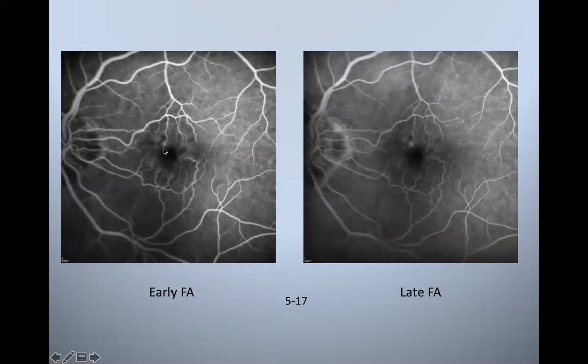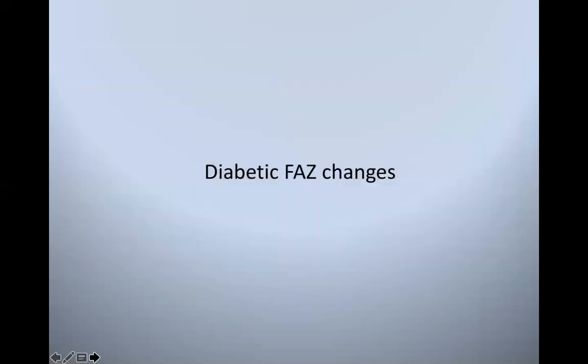You know, we thought, oh, there's a leakage there, but it really didn't amount to much. This is 7-8 minutes into it. There's nothing going on there. But there is that neovascular complex sitting under there. So just be aware that even though the patient presents with dry AMD, scan them anyway, because you never know what you're going to find.